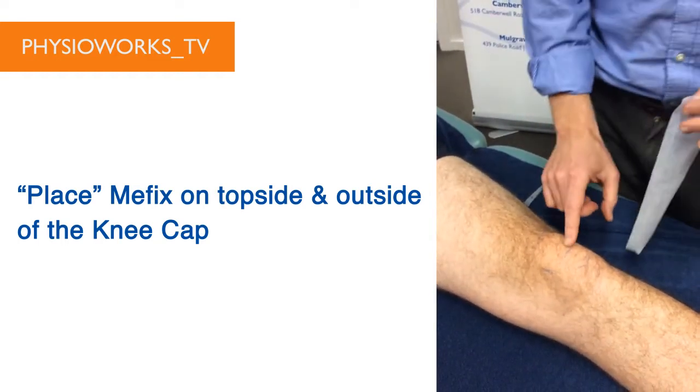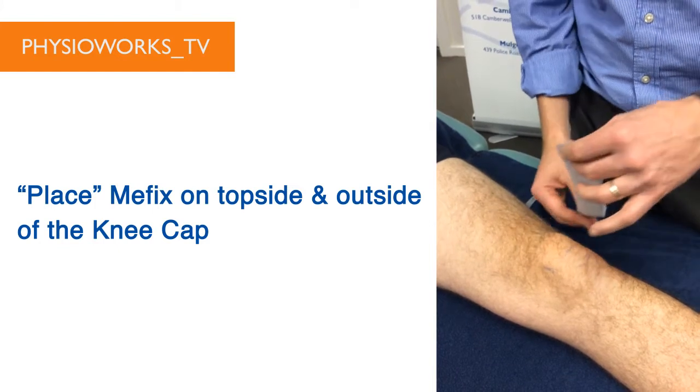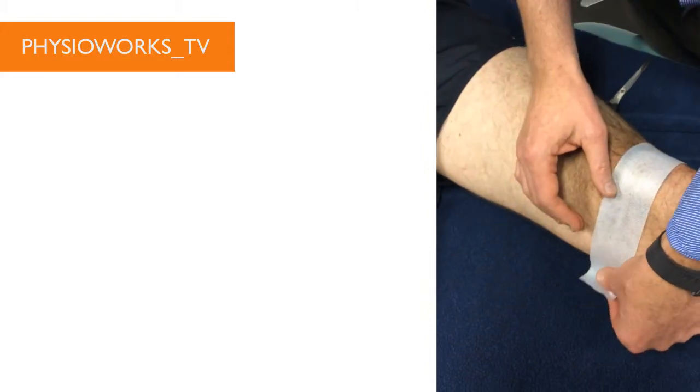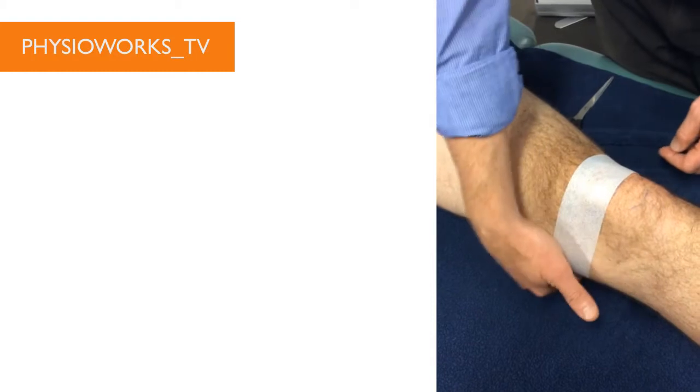In applying it, it's the top half of the kneecap. You apply it on the outside of the kneecap about halfway down, as you can see. Don't pull it across, just place it going towards the inside or towards the groin side. Make sure you cover this part of the skin as this is a sensitive area.